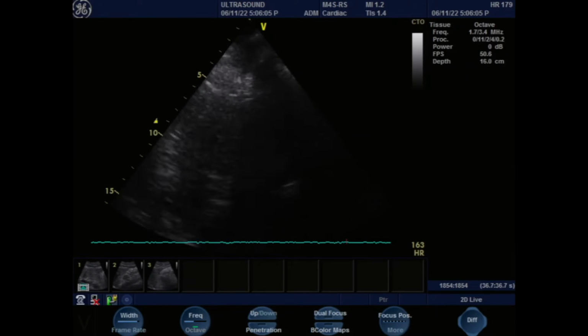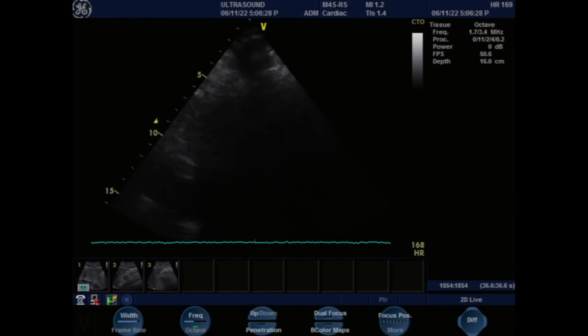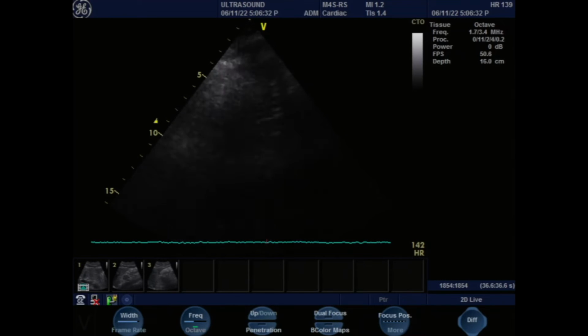So in that way, we're looking at an entire 3-dimensional image of the heart in individual 2-dimensional planes. Quick question. Yes. When you say the inferior view, do you mean the apex of the ventricle, or do you mean on the image? No, the heart's walls have names. There's the anterior wall, anterior lateral wall, inferior septal wall. So those are walls, not where we are in the image. Exactly. Okay.